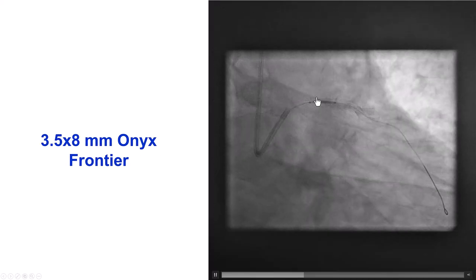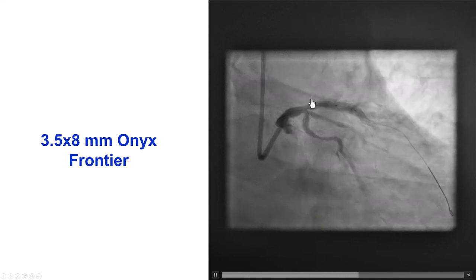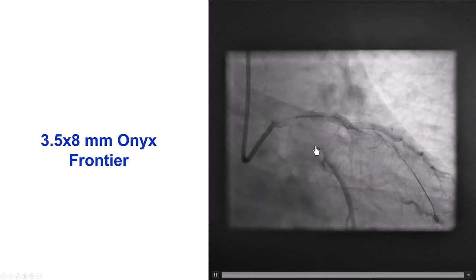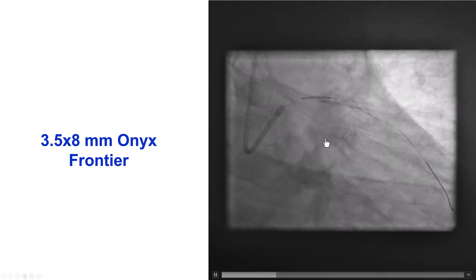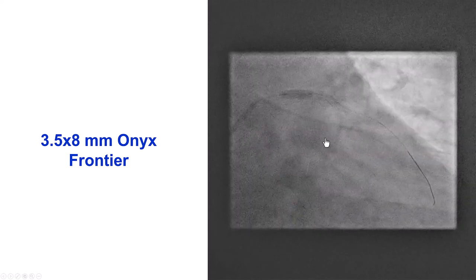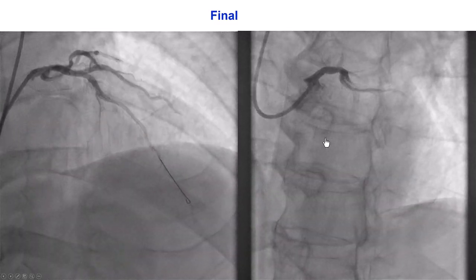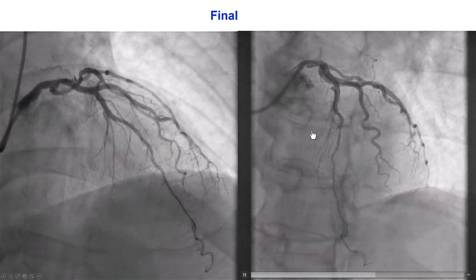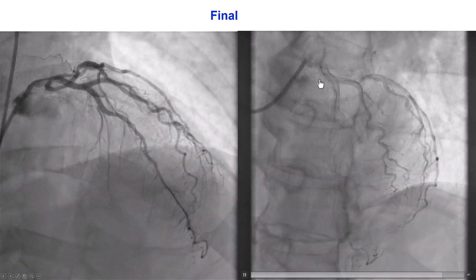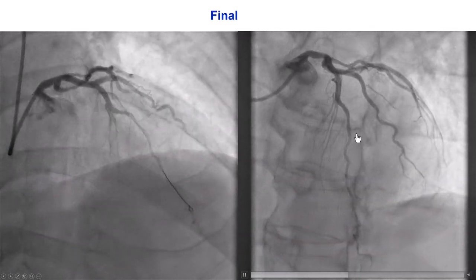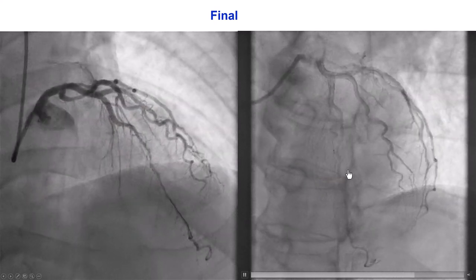There was an area that looked diseased a little more proximal, so we placed an additional 3.5 mm drug-eluting stent that provided a nice final result with excellent flow in both the diagonal as well as the LAD.